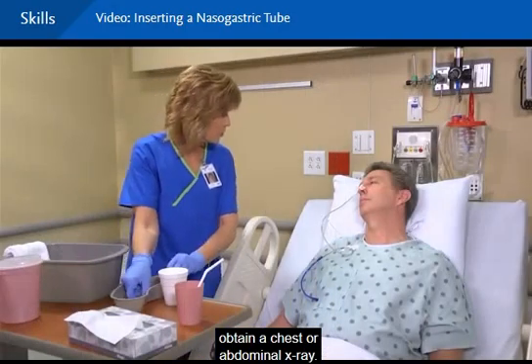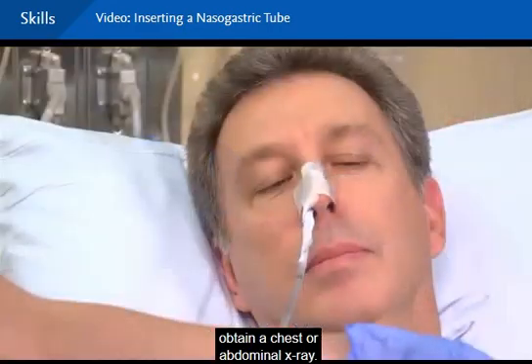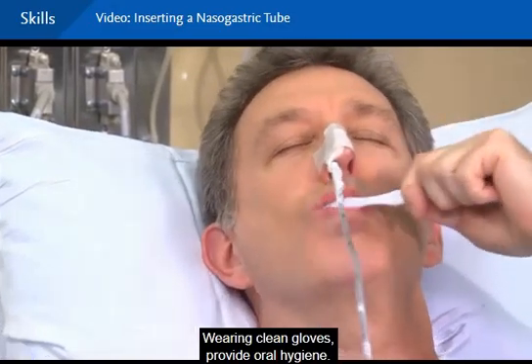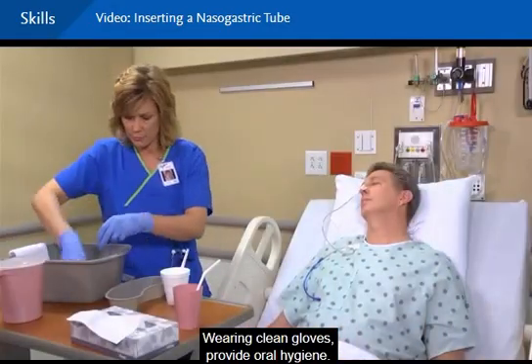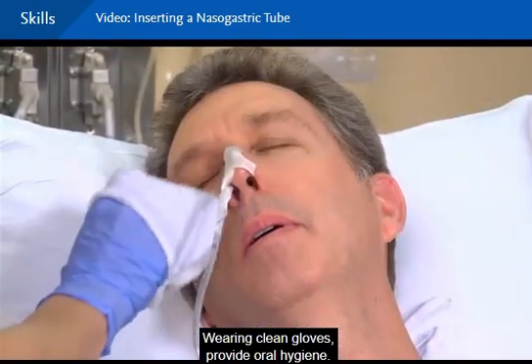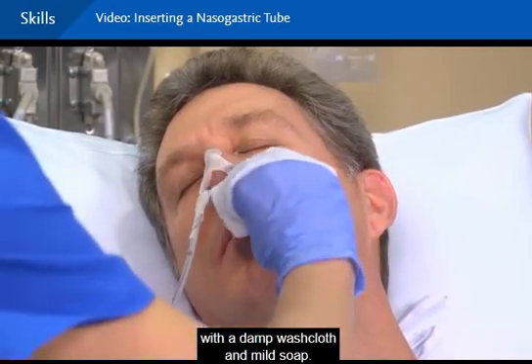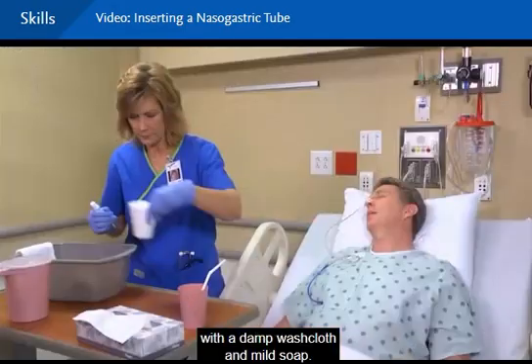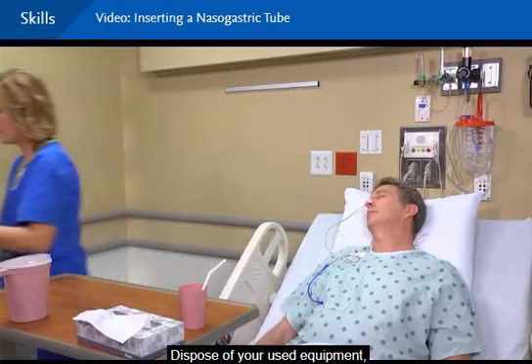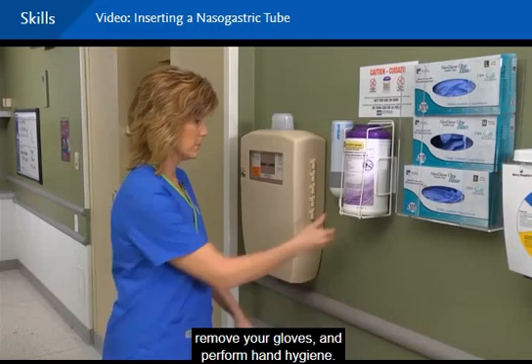All right, we're going to do some oral care now to hopefully make you feel a little better. Okay. Sir? Wearing clean gloves, provide oral hygiene. We're going to clean up around your nose a little bit now for you, sir. Clean the tubing at the nostril with a damp washcloth and mild soap. Dispose of your used equipment. Call me if you need anything. Remove your gloves and perform hand hygiene.